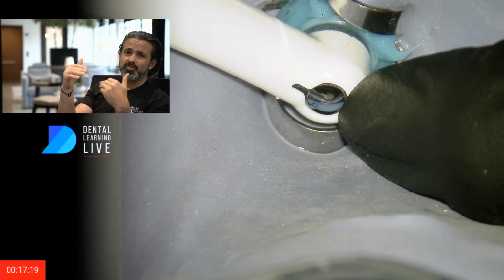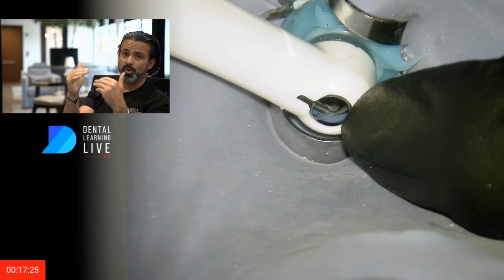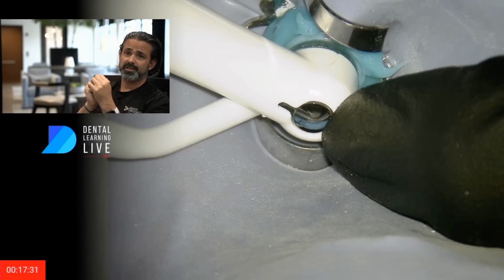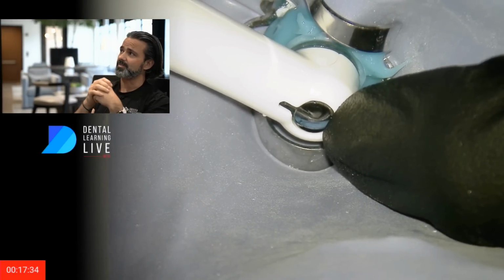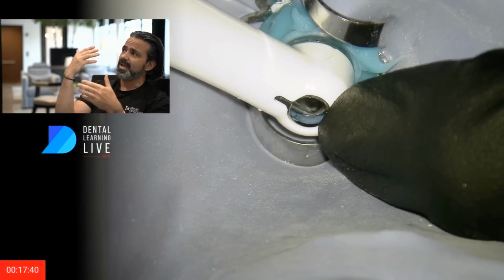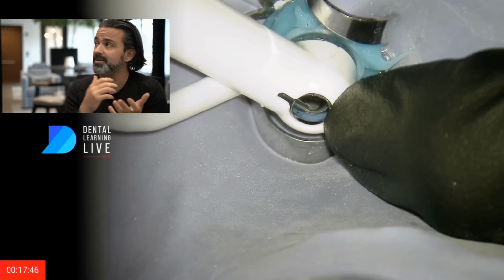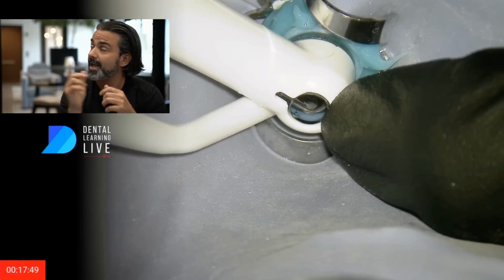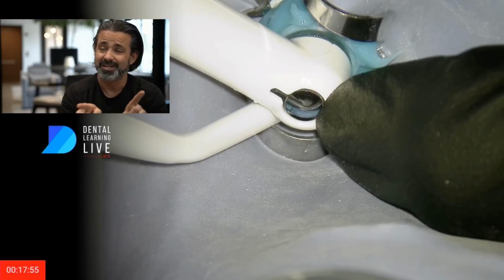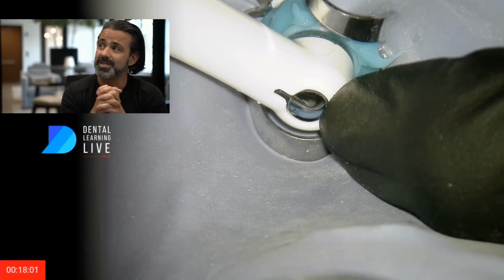It's kind of like running the extended cycle on the molar as far as the times go. It's the 3%, the same protocol, same time, same agents: the sodium hypochlorite, the water, and the EDTA, the same concentration. So 3% is coming in here, sitting over it, and allowing that vortex eddy to come down, and then the echo of the multisonic or broad spectrum sound. That's how they describe it to us, and it goes down through the fluids. The hope is it's going to be lapping up against those two orifices, allowing me to make space and get a better flow with my file, because like I said, I was in a danger zone here.